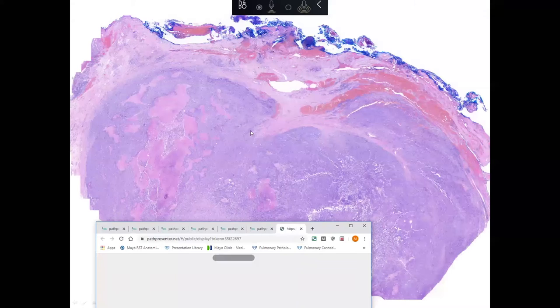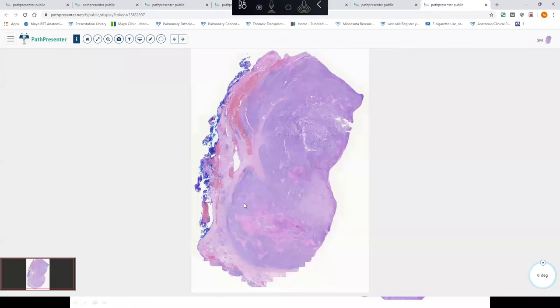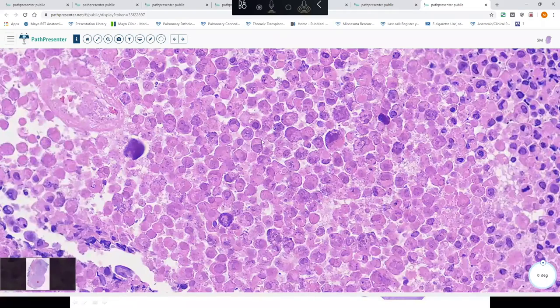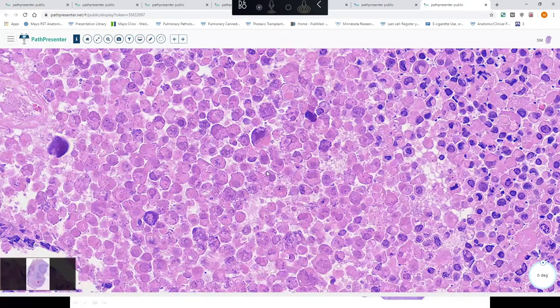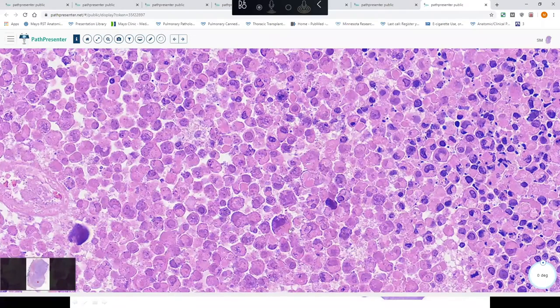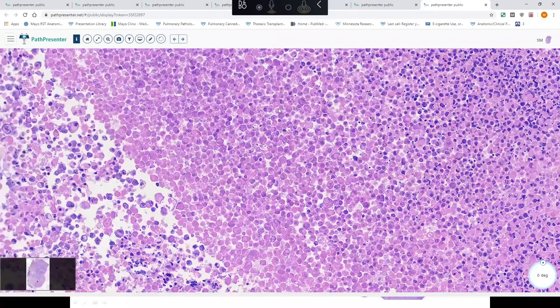So we have our next case here, another big, large lung mass. Looks very blue on low power, kind of diffuse sheets, and we get a sense that there might be some necrosis there. So as we zoom down, we once again see this tumor cell necrosis where you just see these ghost outlines of the residual cells. I think as you can see here, they have a little bit of an interesting appearance in these partially necrotic cells, where you have these nuclei, they're often off to the side, and they have a bit more eosinophilic cytoplasm with these more eosinophilic looking inclusions.